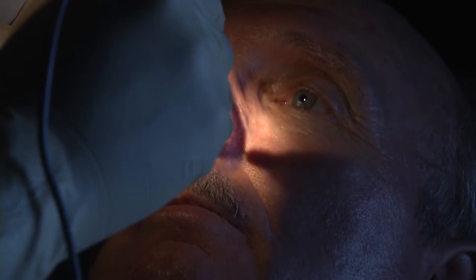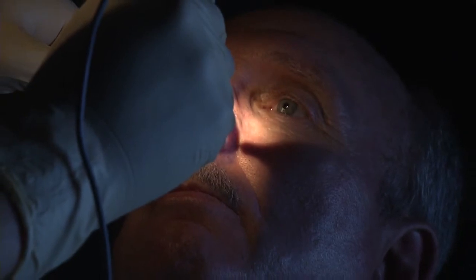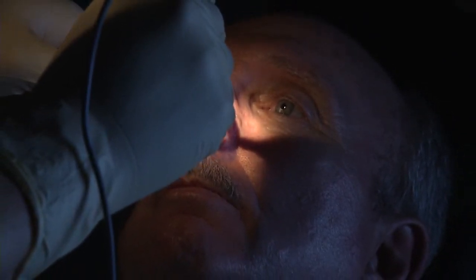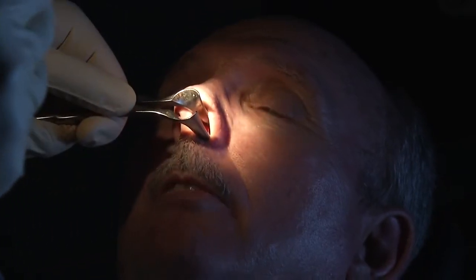Going right in the front part of the tissue right here. Here comes your first 10 seconds. How'd you do with that one? Sometimes what you can do is when I say 'here we go,' just take a little deep breath, because you only have to hold it for 10 seconds. When I'm done, you can just blow it out.